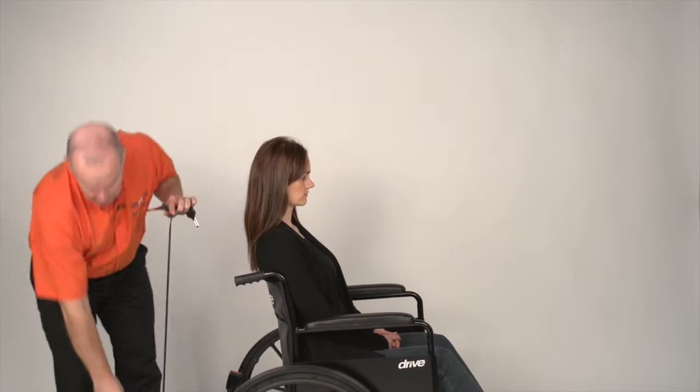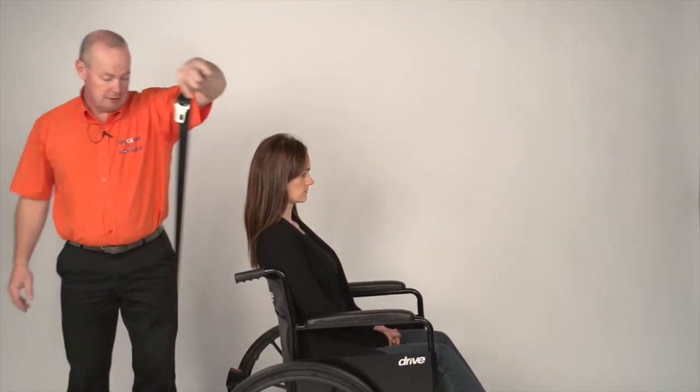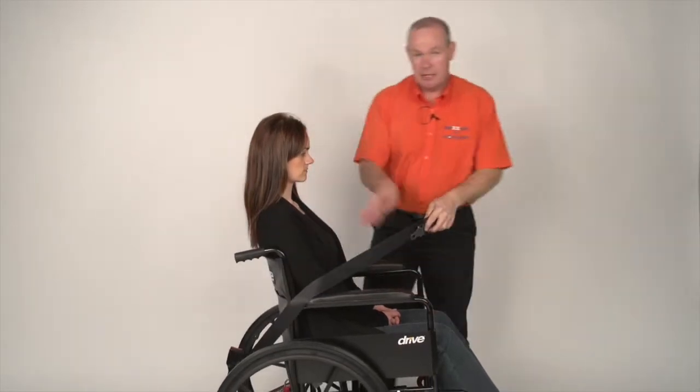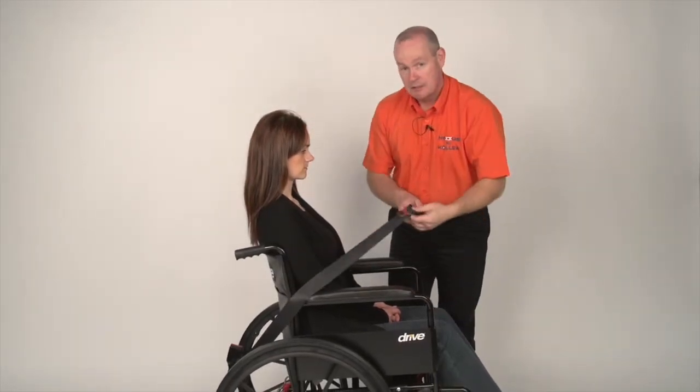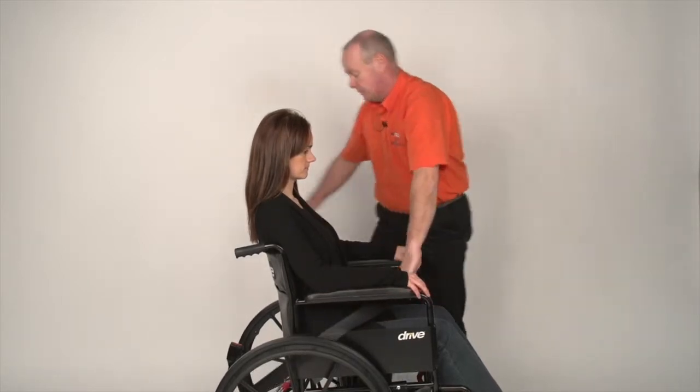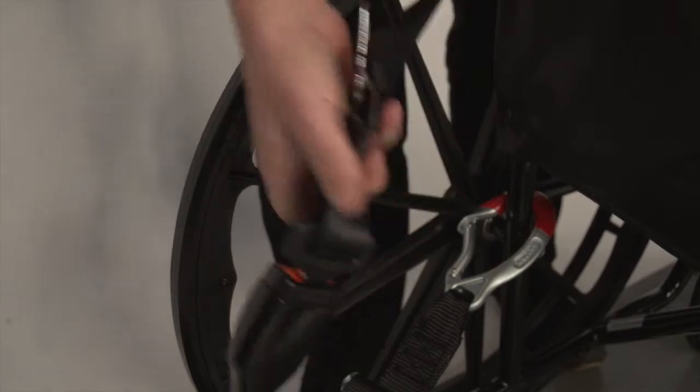Split the reel into two. Let the blue go down and concentrate on the lap belt first. Bring the lap belt around the side of the person, either coming down through the gap in the armrest — if there isn't a gap, come underneath the armrest itself — then across the lap of the person and put the tongue into the buckle.